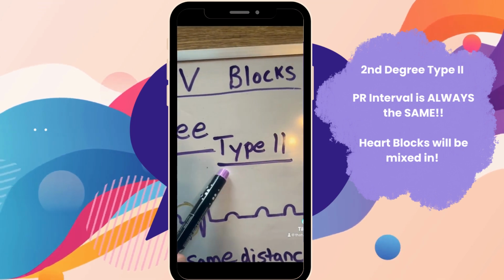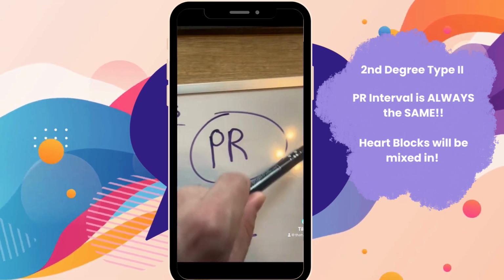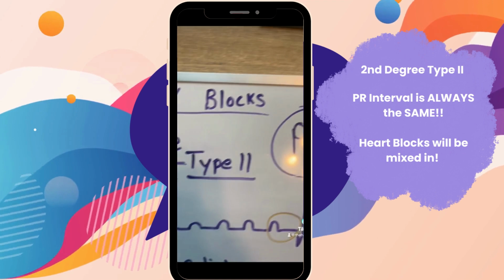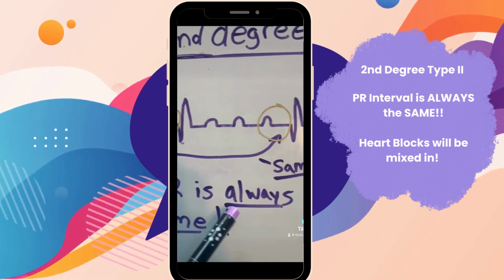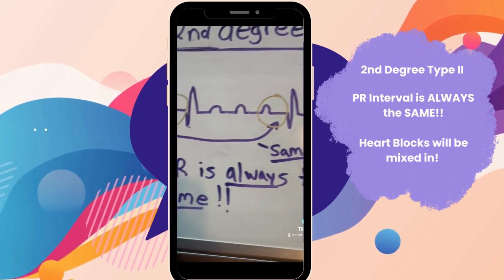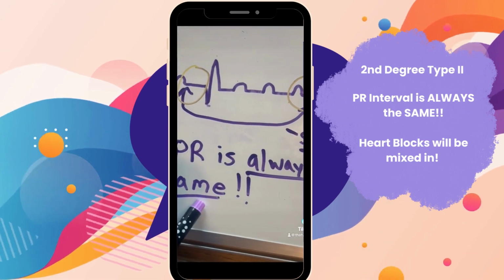Now, second degree type 2 takes it a step further. So once again, only pay attention to that PR interval. And the number one rule you want to remember with second degree type 2 is the PR interval is always the same.